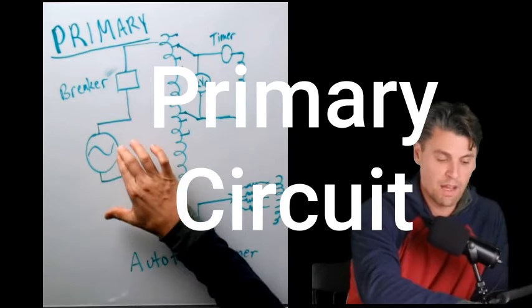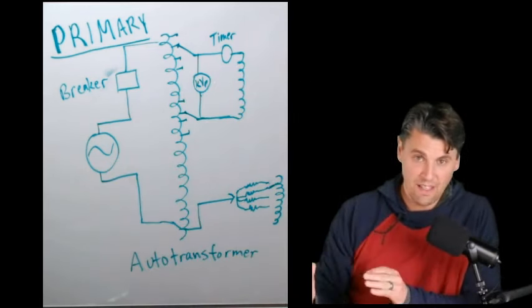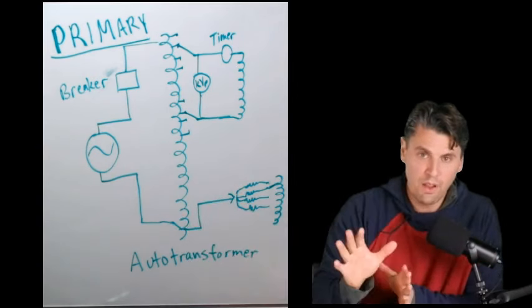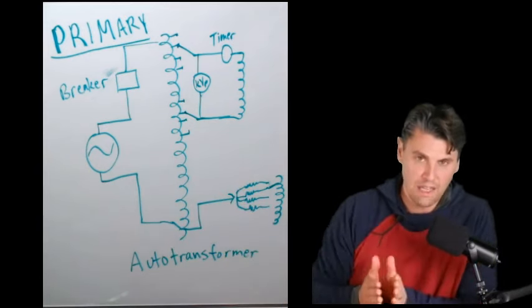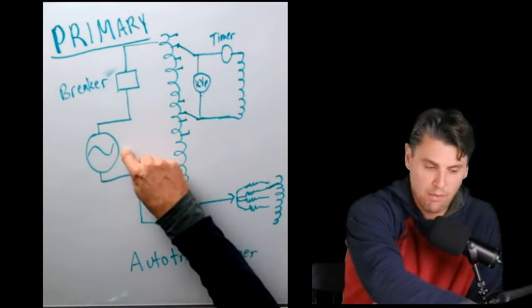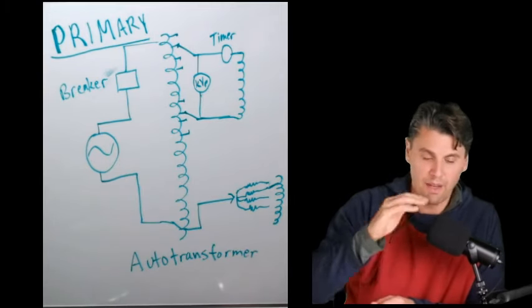From the wall power, we have our primary AC input. See our video on AC versus DC. And we also have a video coming out soon on transformers. Transformers don't work with DC current. Transformers are really required here in order to change the voltage and change the current at different parts in our circuit. They really require this AC current. AC is alternating current, just going up and down quickly.